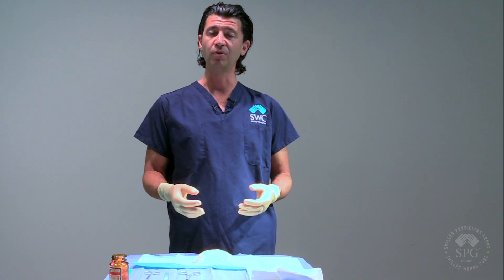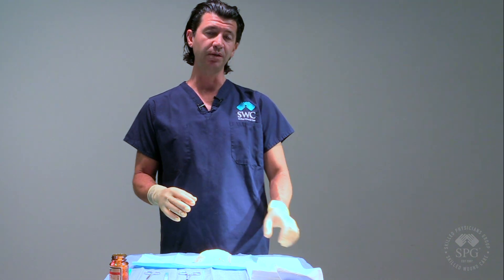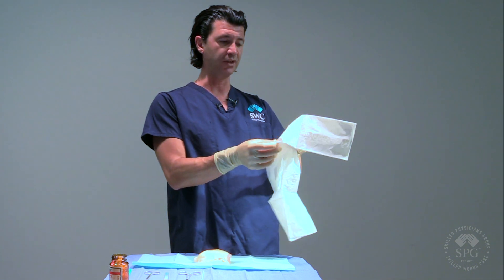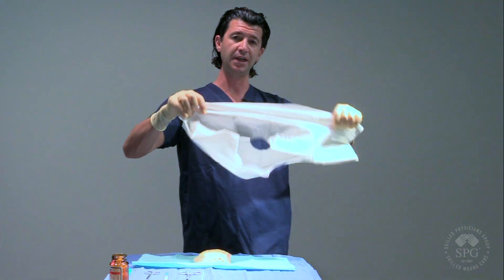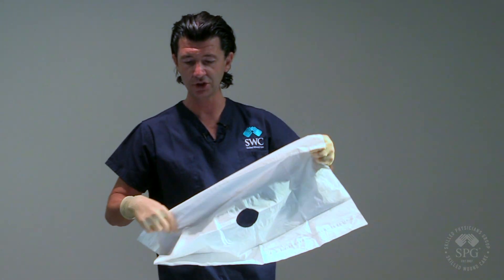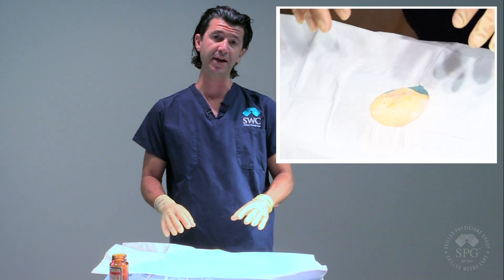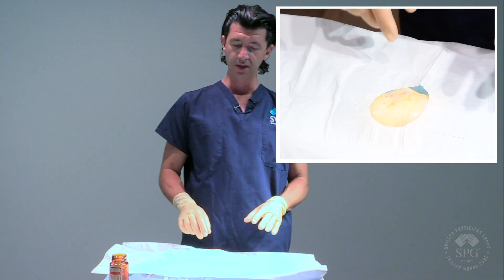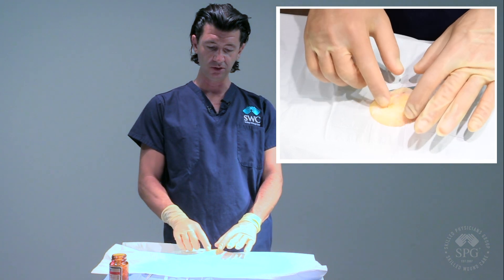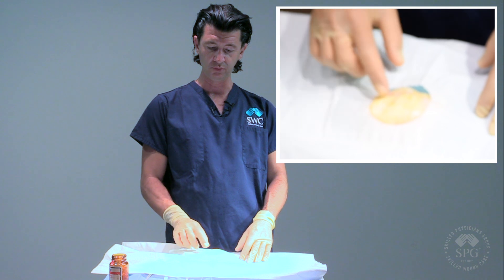In addition to drainage of an abscess we also will use antibiotics, but in this video we're going to be focusing on the actual procedure. The first thing we like to do is keep the area clean, so I put one of these covers — from an incision and drainage kit — over the abscess area. You can feel here that we have an abscess, and usually we can feel with our fingers where the abscess pocket is. It'll be fluctuant, meaning it'll shift a little bit and be soft, and then we'll know there's fluid underneath.